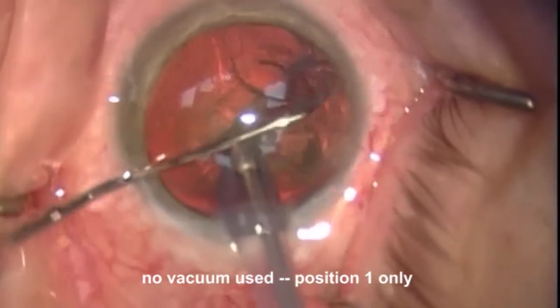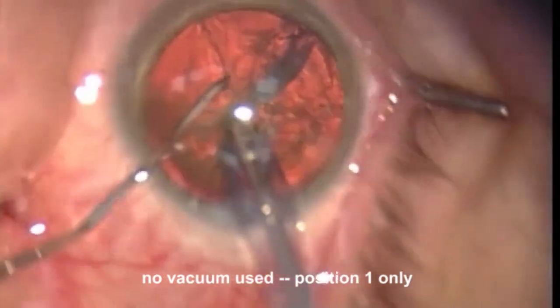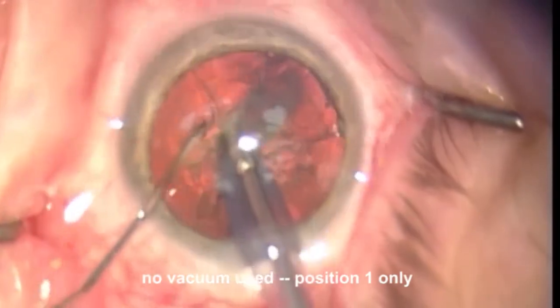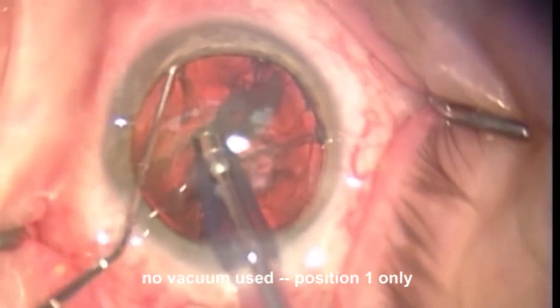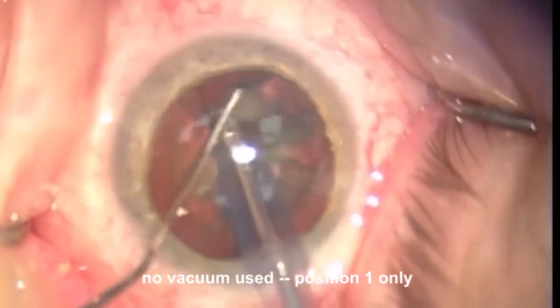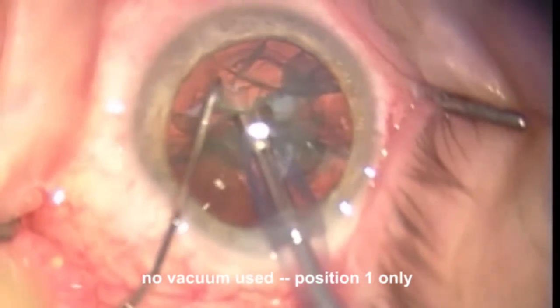You can see we just position the FACO needle on top of the lens and just bore in just a little teeny bit. We're going to get the FACO needle kind of low, support the nuclear material, go out and do this horizontal chop, coming all the way to the left side of the FACO needle. And now we have used no vacuum and have chopped this soft lens.